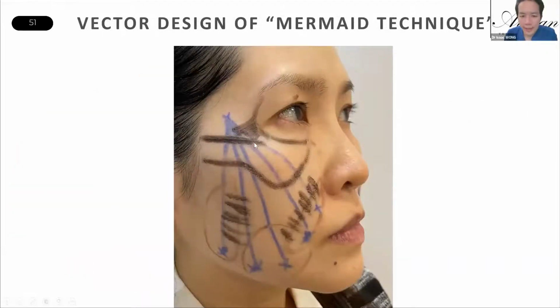This is the vector design. The entry point is here in the temple, and the threads go down, 2 to the nasolabial fold, 2 to the jowls, and you can even put 1 at the lateral cheek fat here. It passes through the lateral orbital thickening, the zygomatic cutaneous ligament, the buccal-maxillary ligament, the nasolabial fat, the jowl fat, and the masseteric cutaneous ligaments.